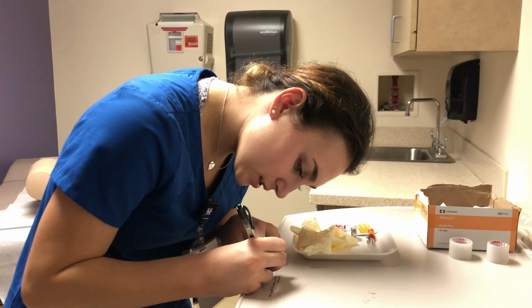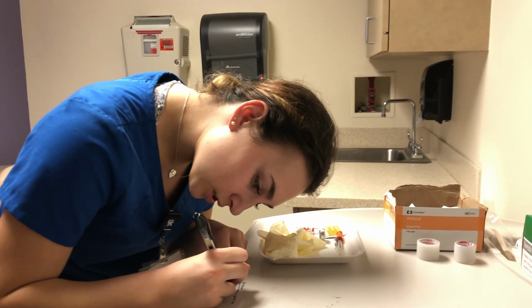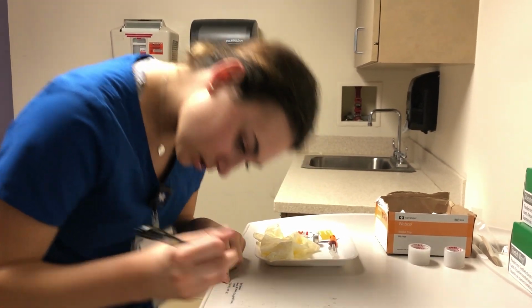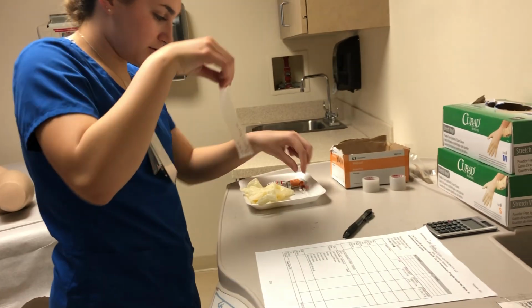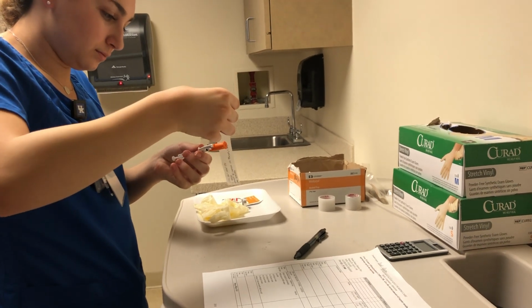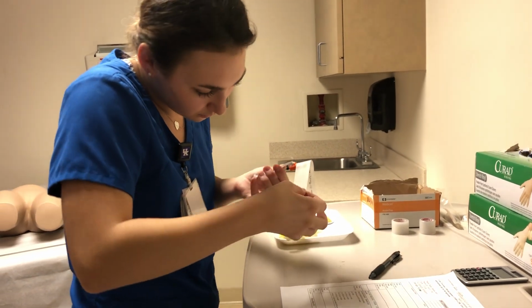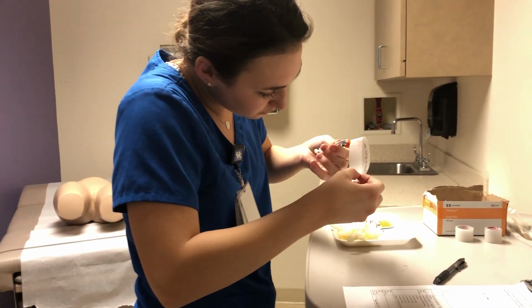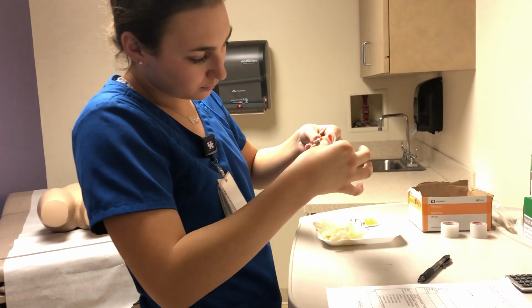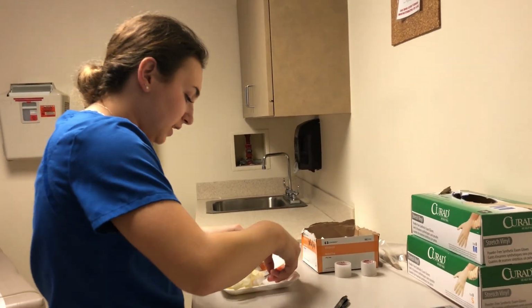and today's date is February 10th of 2020. It is 11 o'clock in the morning. I'm going to initial this. So now my tag is prepared, and I am going to put it on my syringe. Okay, so my syringe is prepared to take into my patient's room.